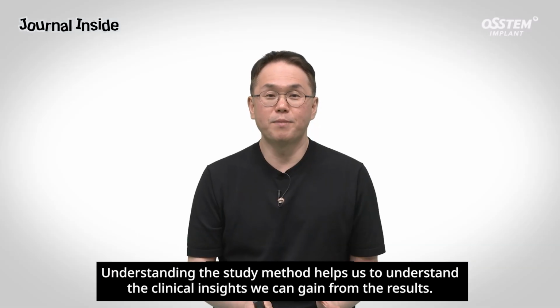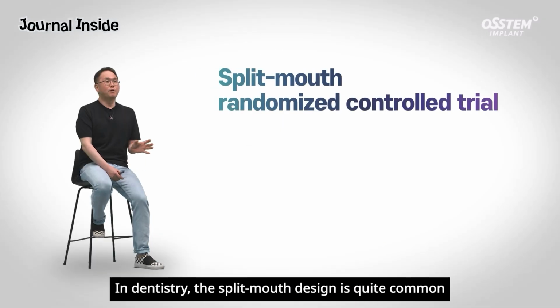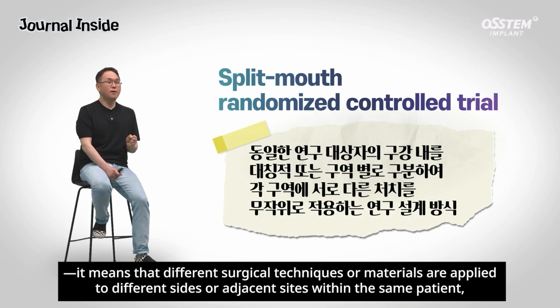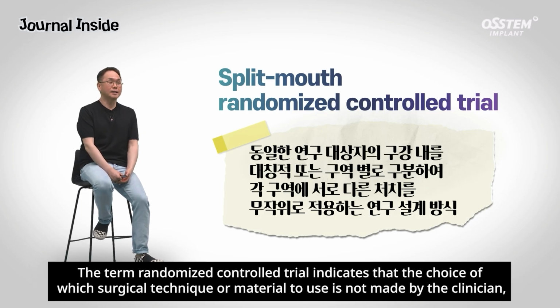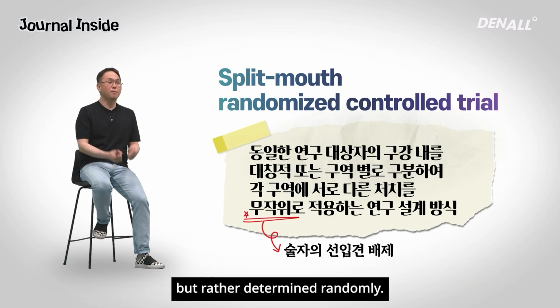Understanding the study method helps us to understand the clinical insights we can gain from the results. In dentistry, the split-mouth design is quite common. It means that different surgical techniques or materials are applied to different sides or adjacent sites within the same patient so that we can directly compare their clinical performance and effectiveness. The term randomized controlled trial indicates that the choice of which surgical technique or material to use is not made by the clinician, but rather determined randomly.